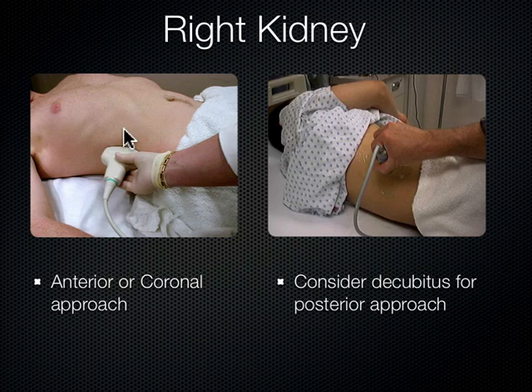Okay, so I'll say that again. From the coronal view, you can drag the probe up anteriorly, and then you're going to tilt the cable towards the ceiling. By doing that, you're fanning the probe, shooting the sound more posteriorly. Many times, that anterior approach, using the liver or the spleen as your window to see into the kidney, is actually a better way to go than even a coronal view. Every patient's different here. This is the art of sonography we're dabbling in right now.